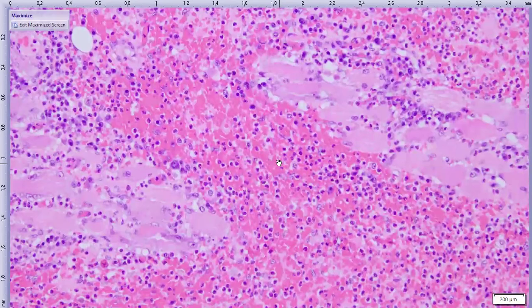That's a good point, because especially in horses, we'll get some conjunctival periocular mast cell tumors where the vast majority of the cells are eosinophils. And then you do a toluidine blue and you find a significant number of mast cells, and some of them have some degree of pleomorphism. Not super pleomorphic, but not quite well differentiated. Yeah. So it was worth a check, but we didn't find anything that looked like a neoplastic mast cell population. Very cool case. Very weird case.